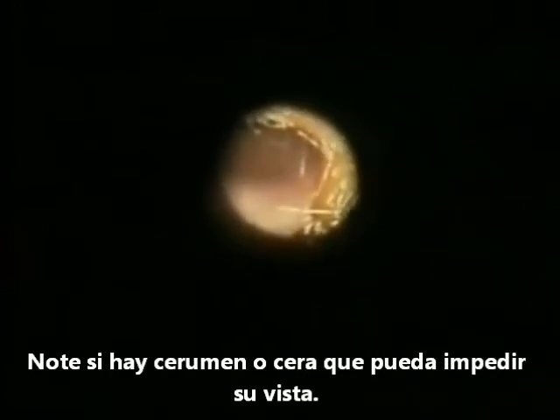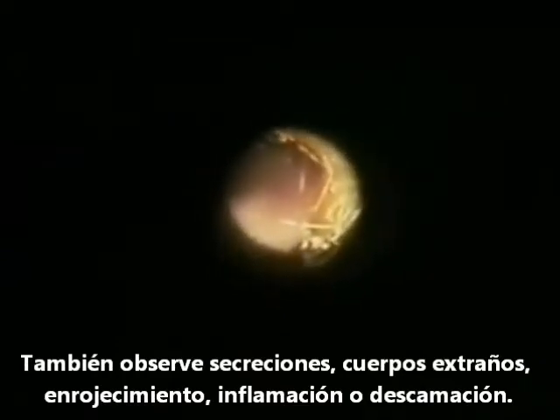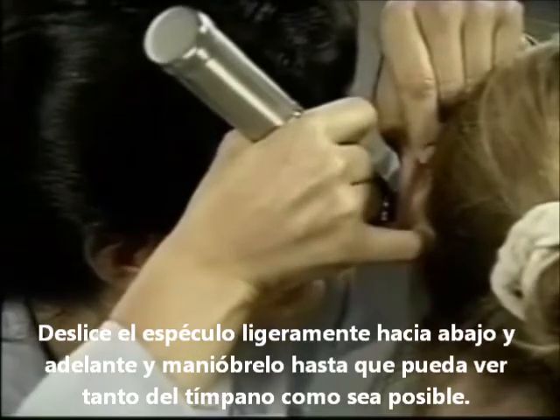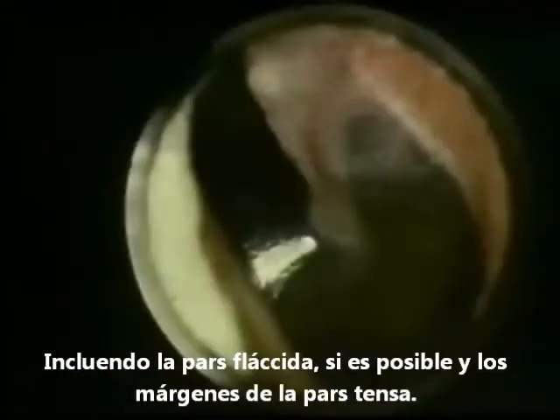Note any cerumen or earwax that may impair your view. Also observe for any discharge, foreign bodies, redness, swelling, or scaling. There should be none. Slide the speculum slightly down and forward and maneuver it until you can see as much of the eardrum as possible, including the pars flaccida, if possible, and the margins of the pars tensa.